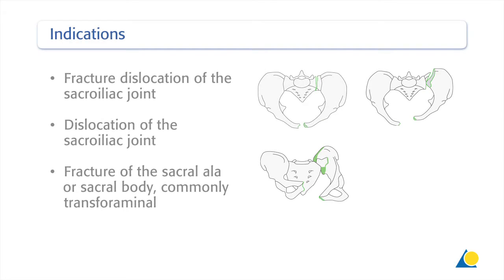The indications for this technique are a fracture dislocation, or a dislocation of the sacroiliac joint, or a fracture of the sacral ala or sacral body, commonly transforaminal.